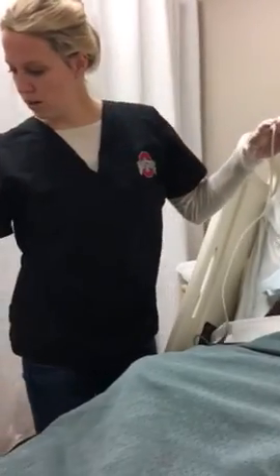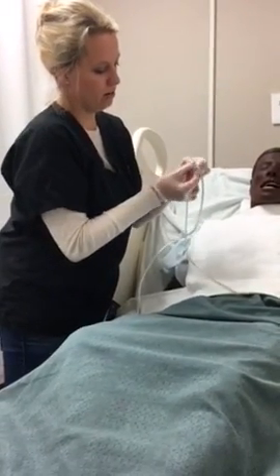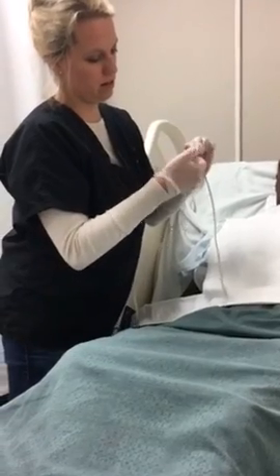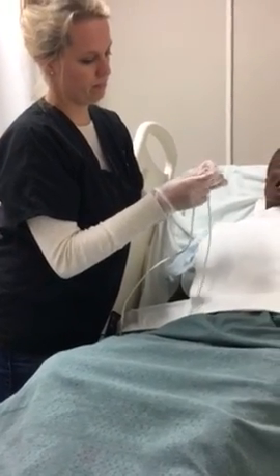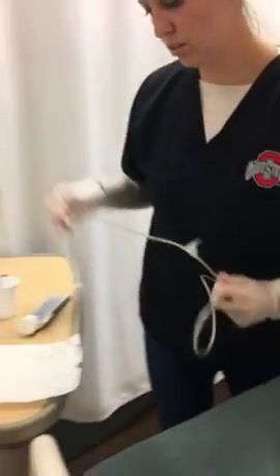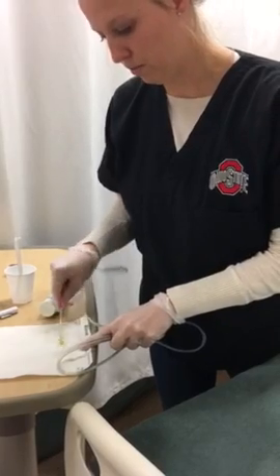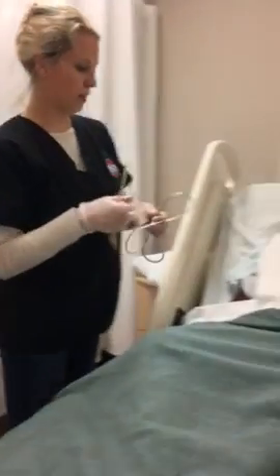So once I have that marked, it just says gathers all equipment. Oh, I'm just going to say that I gathered my equipment at the same time for the video. And then I'm going to lubricate. Do you want to get 3 pieces of the tape? Well, no, you said you wanted to do that before, remember?